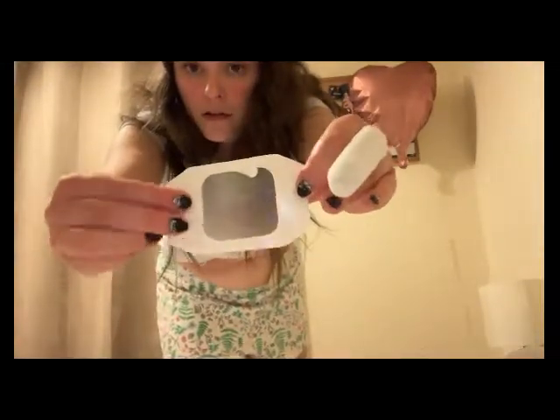It's like the plastic, if anybody's ever had numbing cream on the hand and that film that goes over the top before they have a blood test or whatever as a kid, it's basically that sort of plastic. It's very, very thin and it works very well. So, stick that over the top. There we are.